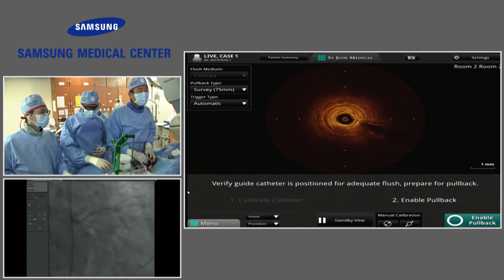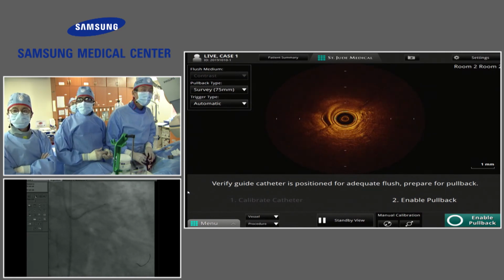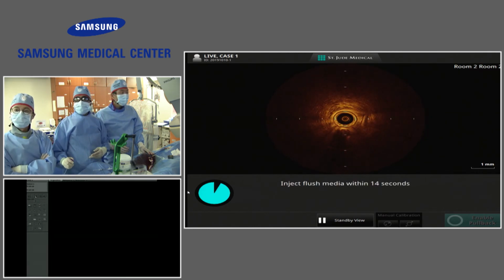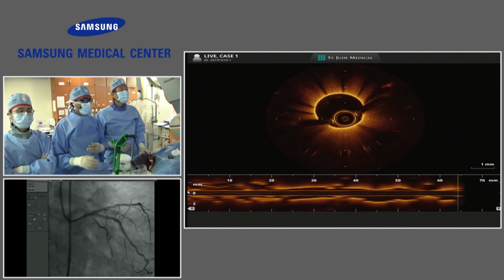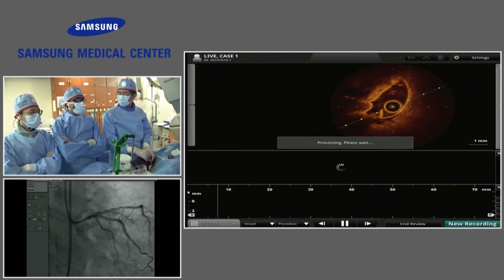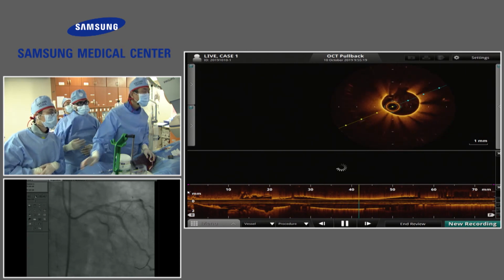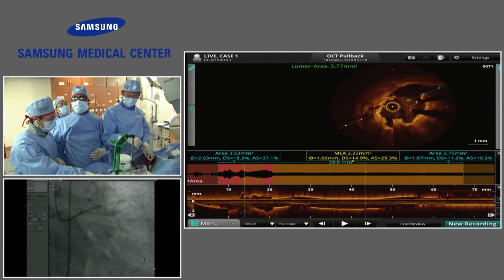It's not going in. That's okay, we can do the ostium here, just the ostium. So there is some dampening. Okay, pressure is good. It is not a dissection, right? There is another dissection. It can be the catheter itself, maybe also from dilation, let's see. Okay, so let's see what we have here.